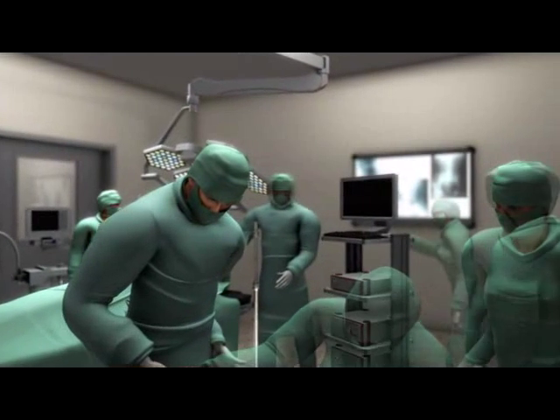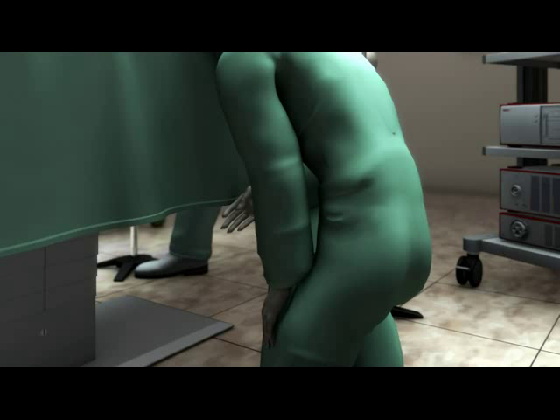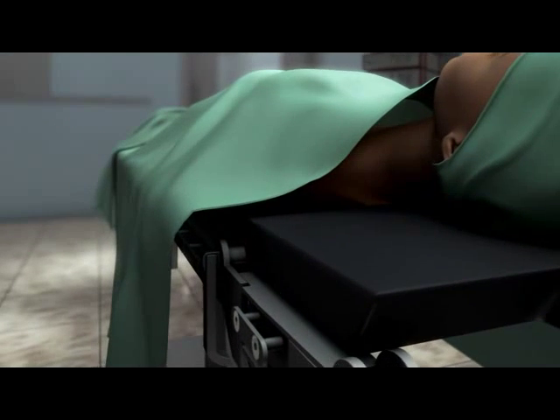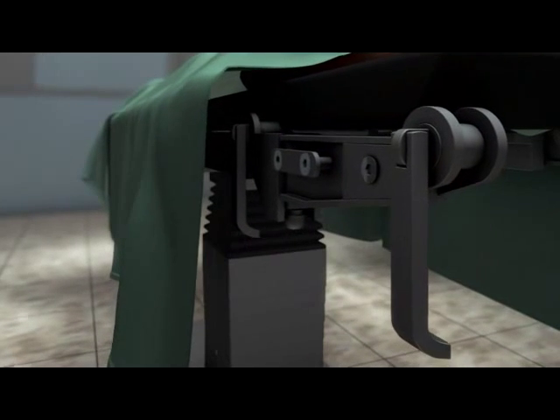Not an untypical problem. The remote control for the table can't be found. A member of the team has to crawl under the table and position it manually. Core delivers wireless control for the operating table in the Core operating theatre.